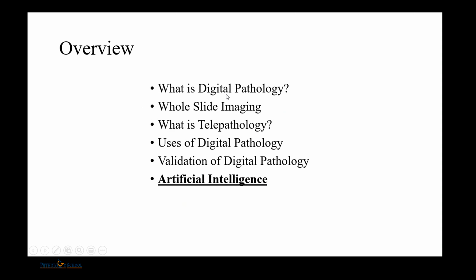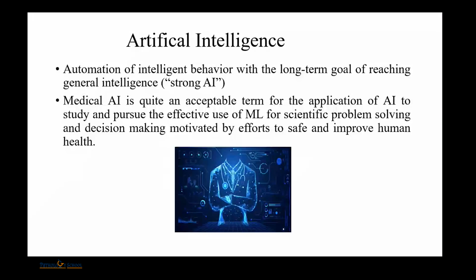your deep learning. Deep learning is a subset of machine learning, and in deep learning, it's a neural network system where you feed in numerous data, and it learns from that data, finds hidden patterns in it, and is able to diagnose. And this deep learning was used in Gleason grading. And next is machine learning. Machine learning automatically learns from the data that it is exposed to.